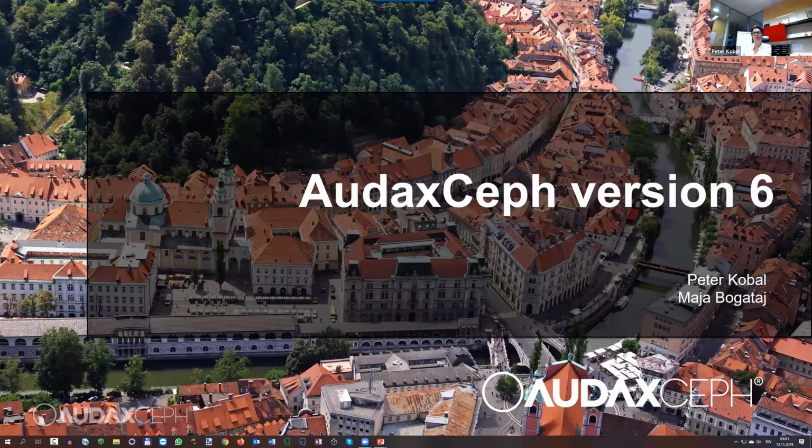We are going to talk about AudaxCeph version 6 software with all the new added functionalities and improvements that were made to the software so you can use it more productively in your practice. Before we get started, I want to go over a couple of items so you will know how to fully participate in today's webinar.